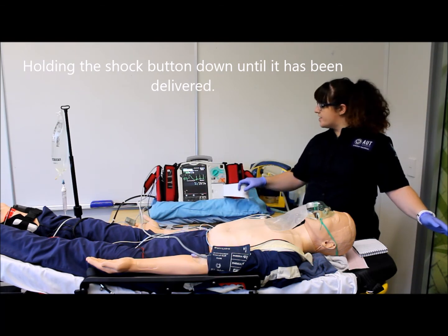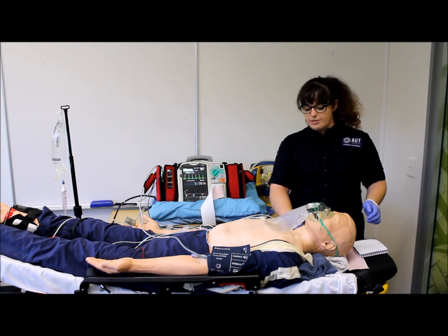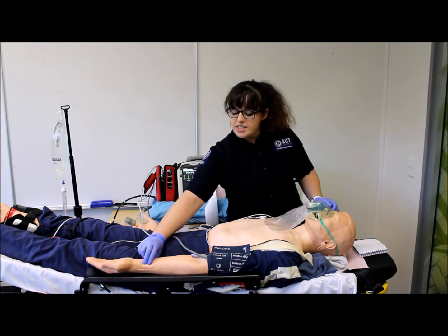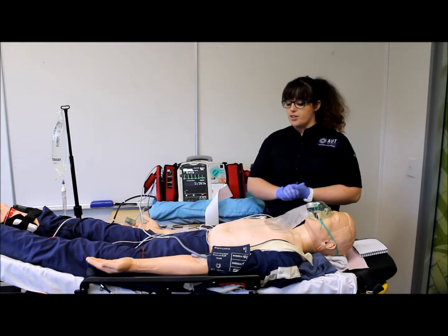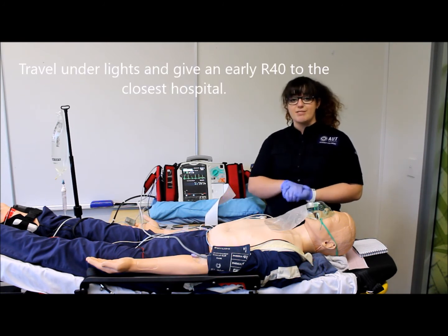Okay, shock has delivered. And it looks like we have gone into normal sinus rhythm, so I'm just going to check for carotid. Nice strong carotid. Check for a radial. Still no radial, so we're going to keep our fluids going and get to hospital. Patient still doesn't look like he's regained consciousness, so we're going to just travel fast.